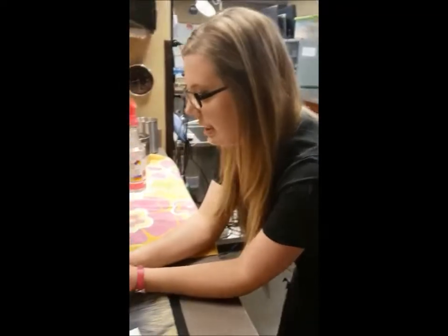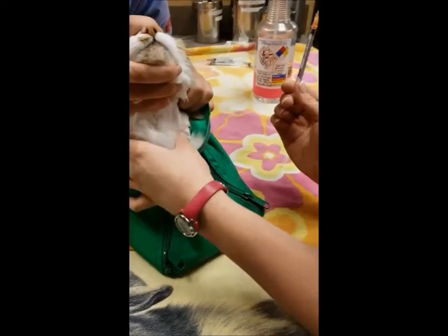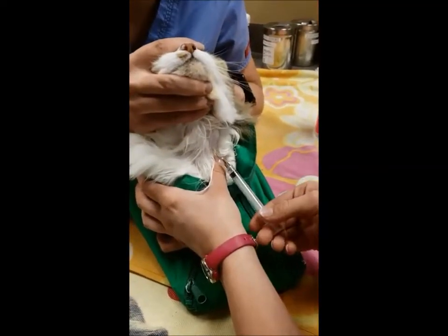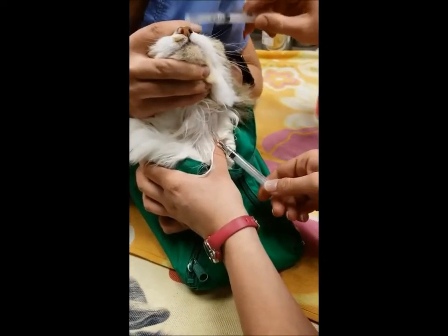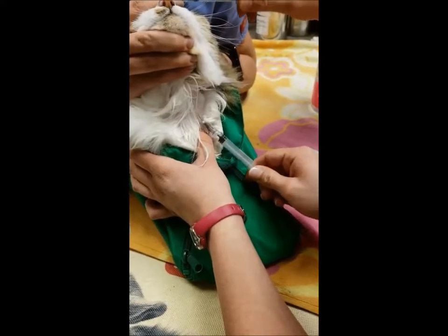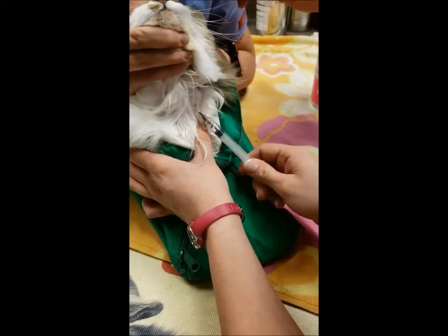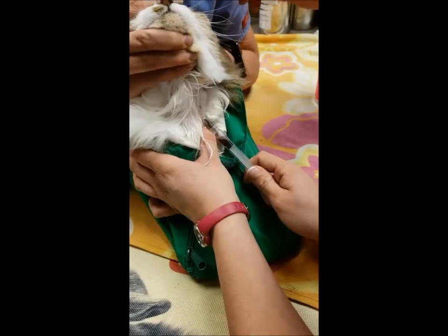So we are going to do a jugular blood draw on a cat. And so I'm going to hold off on the thoracic inlet. Mally, stop. Okay, buddy. Good kitty. It's okay. Here's your flash. Here's my flash, and I'll get a little sample.